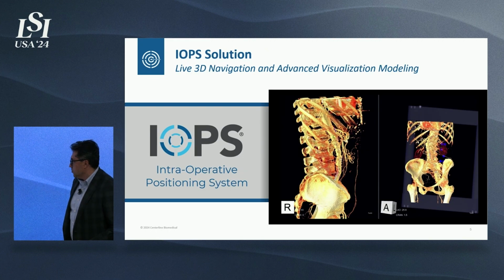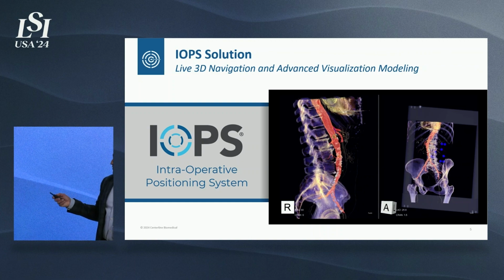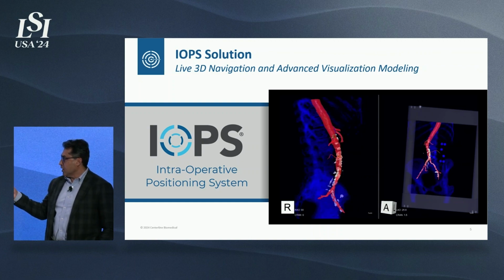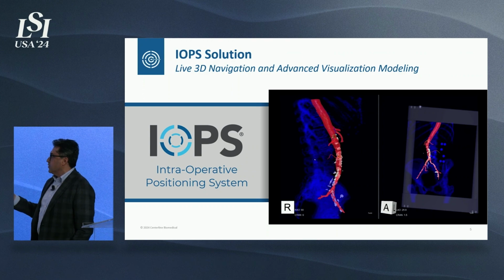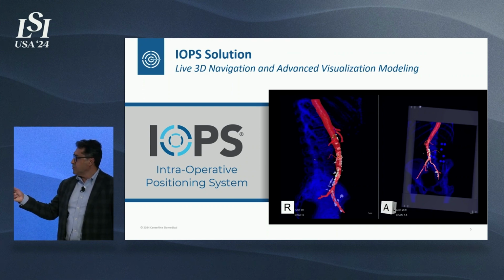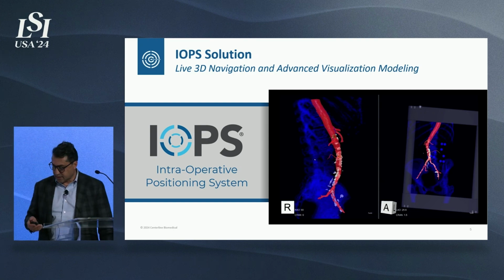So here's our system, at least an example of many of the things that we can do. This is a preoperative CT scan, and we have merged a map that we've created of the aorta onto it. The key takeaway is you can actually now see the aorta, right? Not just the bones. This is the part of the anatomy that's going to be treated in this case. You can see some of the vessels that branch off of the aorta, and you can see some of the calcium deposits that have developed.